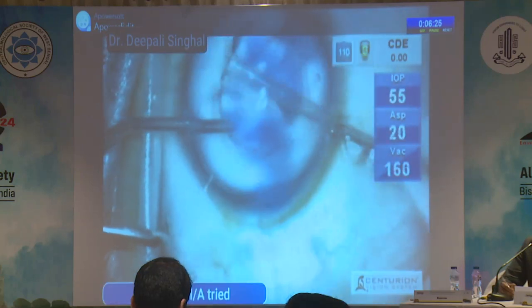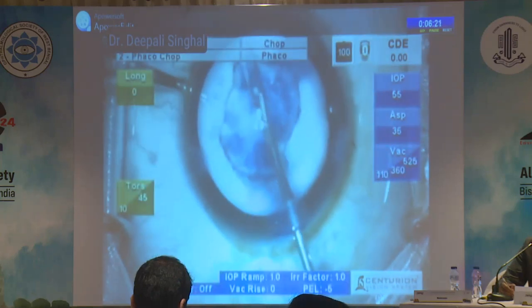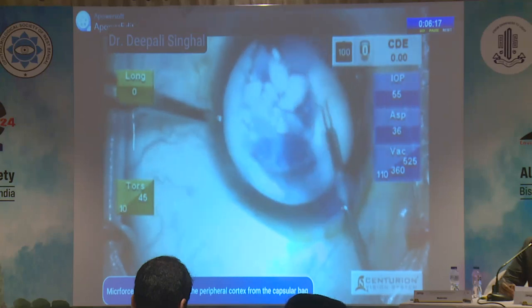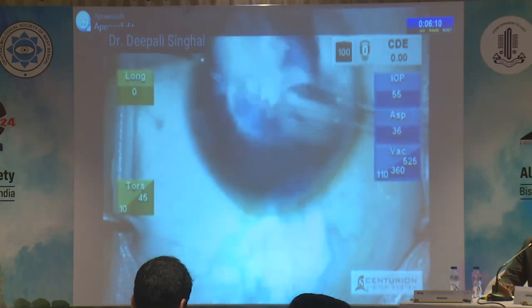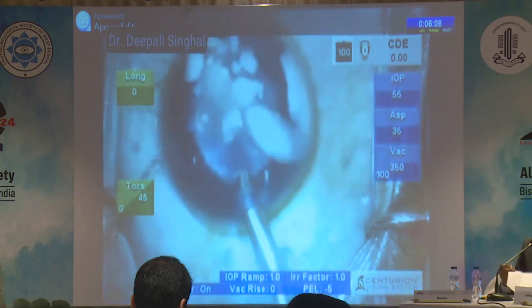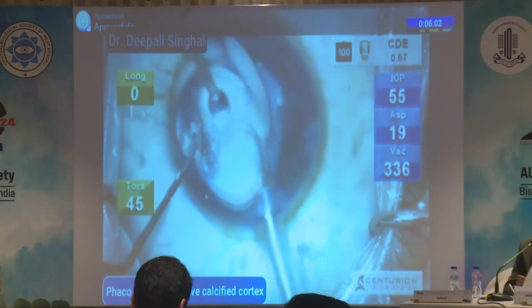First, I tried with bimanual IA, but the lens matter was very hard and fibrosed. So I used forceps to separate and lift the peripheral cortex from the capsular bag. Then I used phaco probe at low settings to remove the peripheral hard cortex.